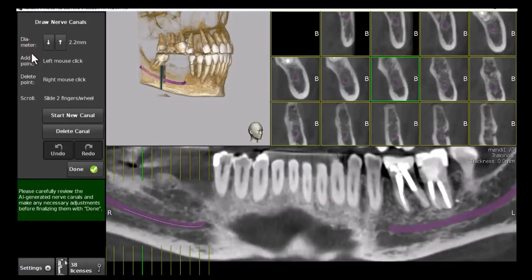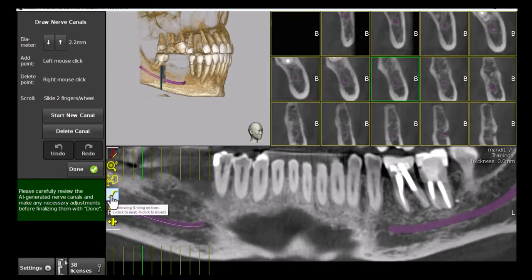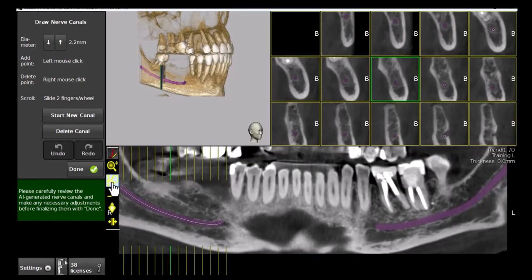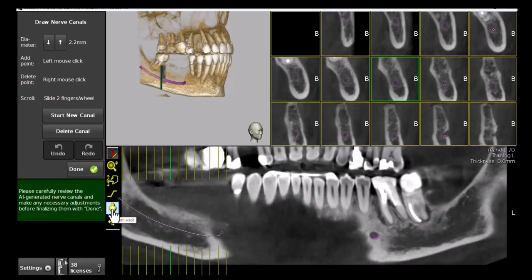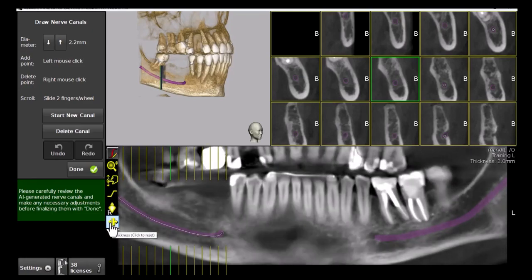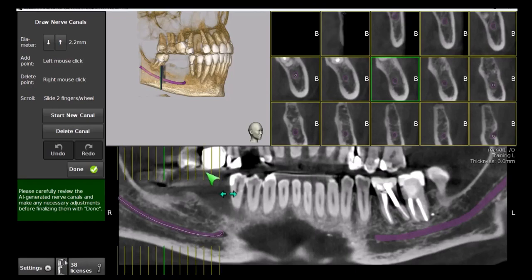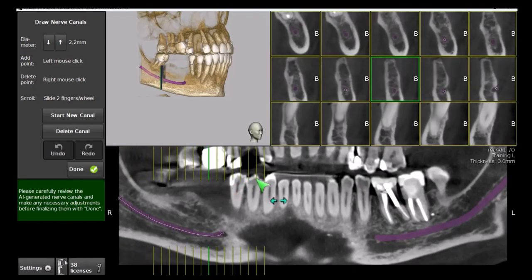First, use the windowing tool in the pop-up toolbar in the panoramic view to adjust the radiographic image brightness and contrast for optimal visibility of the anatomy. You may also zoom in and out, drag the image up or down, scroll through it, and adjust its thickness for more detail or a sharper image. Drag the grid along the panoramic image to review the nerve marking in the cross-sectional views.